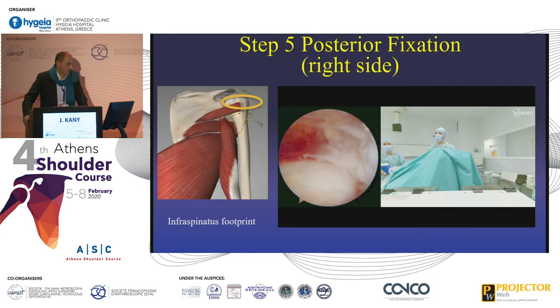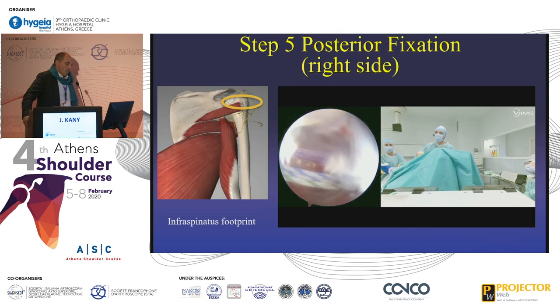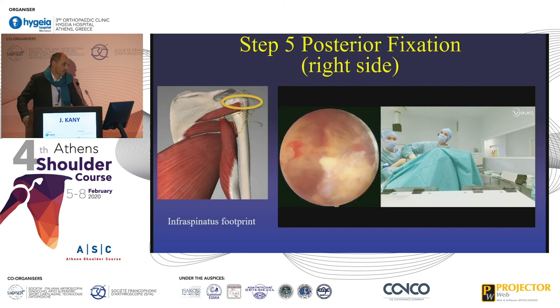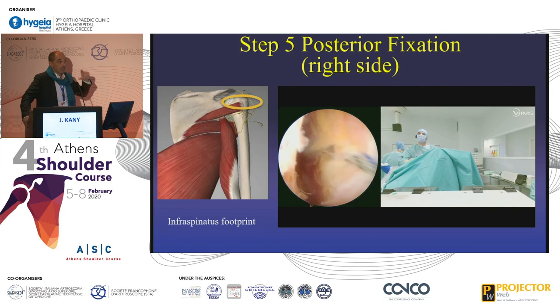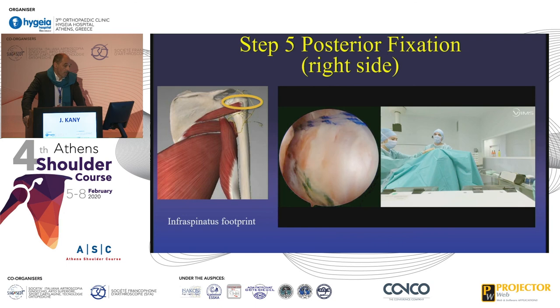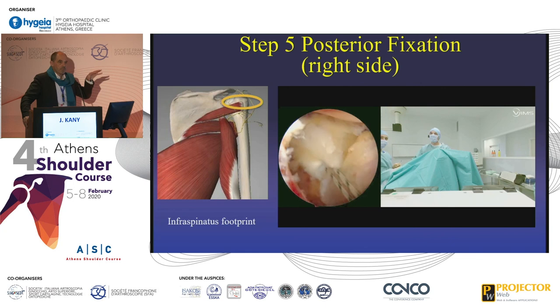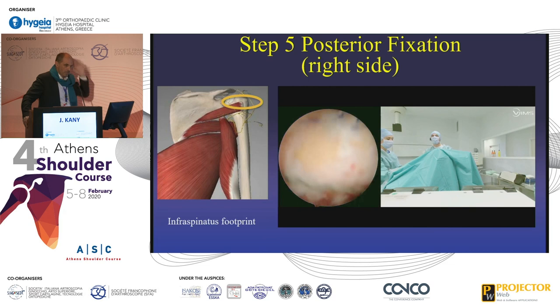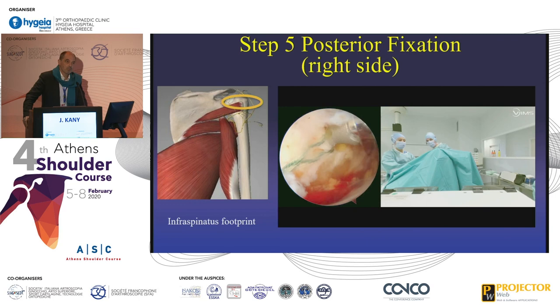The last step is the posterior fixation — I say posterior fixation, not posterior superior, for two reasons. We think the goal is to rebalance the shoulder, not to fill a defect. You can see here the double transfer coming up from the back. We have both the lat dorsi and the teres major — the teres major is in fact short and cannot go over the top. So I fix very easily with two anchors flat onto the footprint, in the neutral position, and I don't try to have too high tension. This could be debatable, because I still have a significant defect on the superior part of the shoulder. The philosophy is totally different from SCR — with SCR you fill the defect. Here, you don't fill anything; you just rebalance the shoulder and fix the double transfer at the posterior part of the footprint.